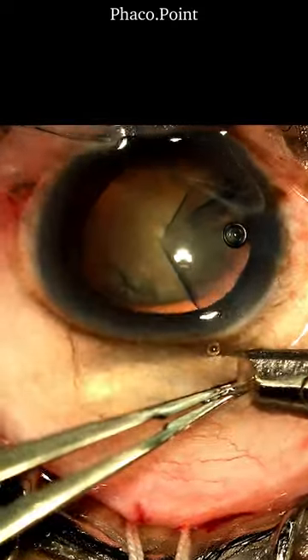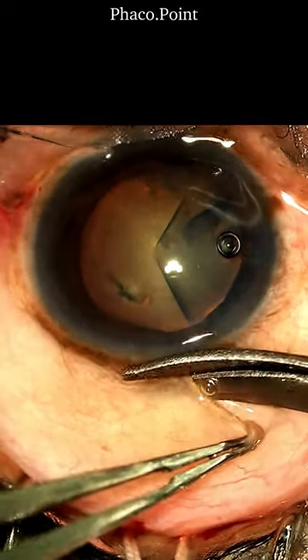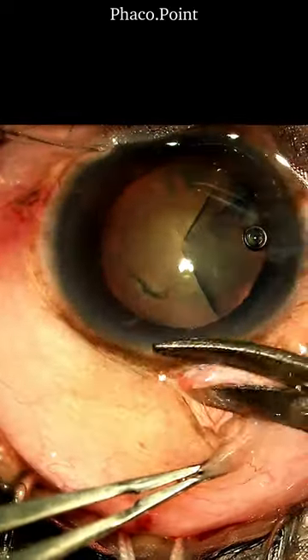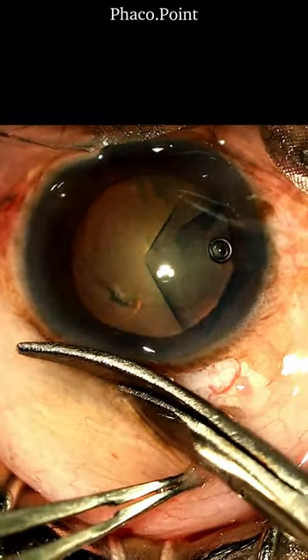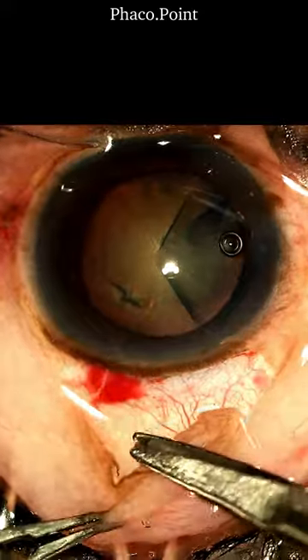Then, following a slight sub-conjunctival dissection, we cut close to the limbus. Ensure that you always leave behind the limbal stem cells. The extent of this dissection should be just beyond the anticipated size of the tunnel. This largely completes the peritomy.